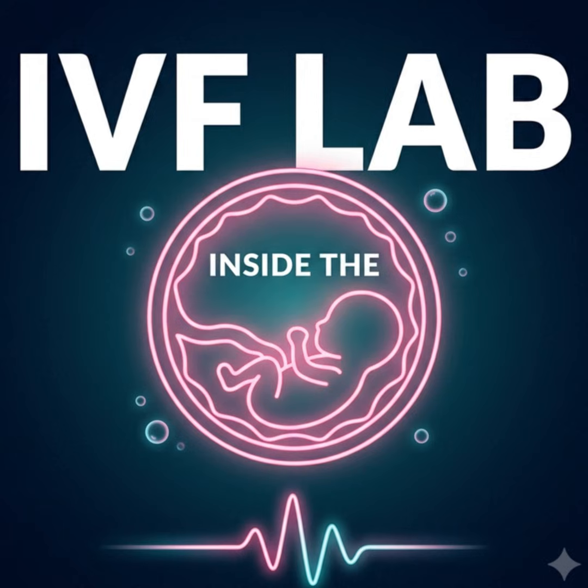Okay, we have to pause here and look at the physical carrier itself, because this tiny piece of plastic might sit submerged in a tank for 20 years. It very well might. How does a laboratory guarantee that when a patient returns 2 decades later, they pull the exact right straw? You can't rely on paper labels or standard ink in an environment that extreme. Definitely not. I mean, at negative 196 degrees, ink smudges, paper turns to brittle dust, and standard industrial adhesives completely fail. Asset traceability has to be an obsession in the lab. It is the absolute foundation of our ethical mandate.